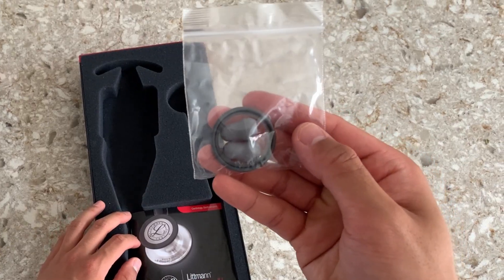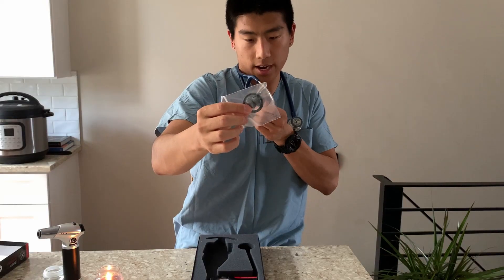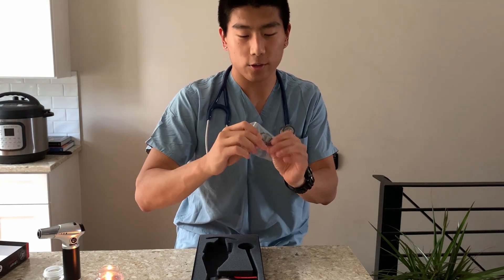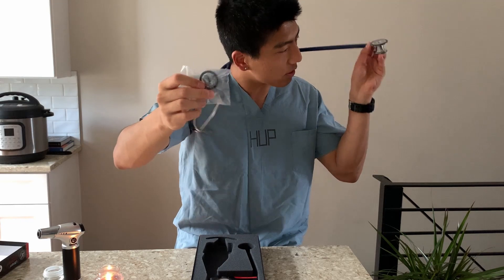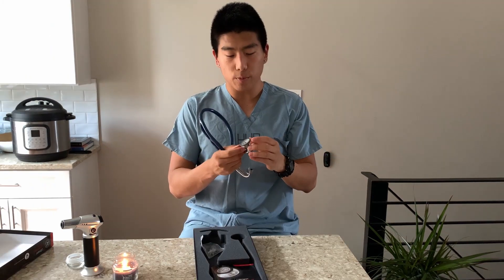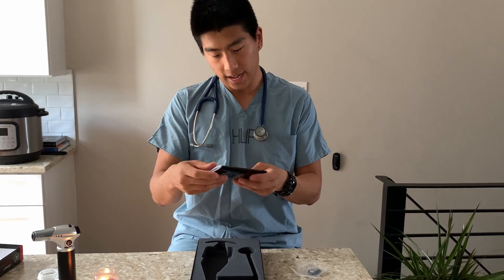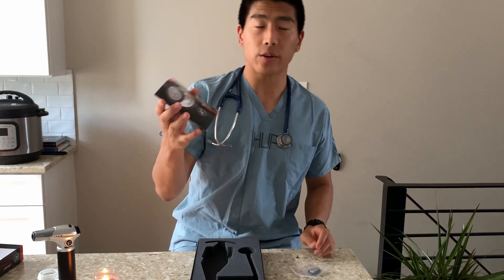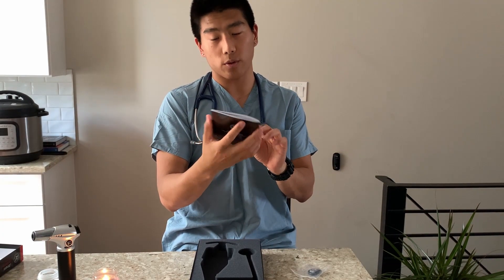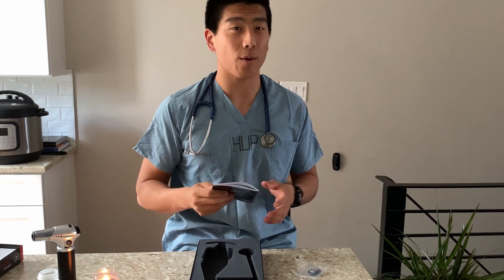So it looks like it comes with two extra earpieces, maybe of a different size — maybe a little smaller than the ones on the stethoscope now. There's also a rubber ring, and it looks like this fits onto the bell of the stethoscope. I believe the small side, or the bell, is used for pediatric cases. And the last thing is a user manual for the Littmann Cardiology IV stethoscope.